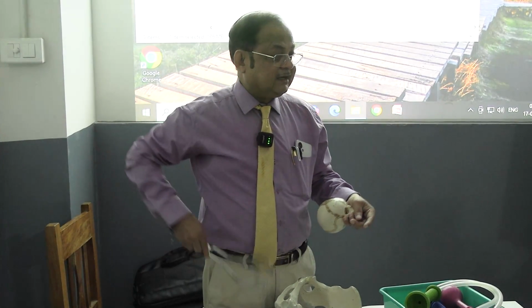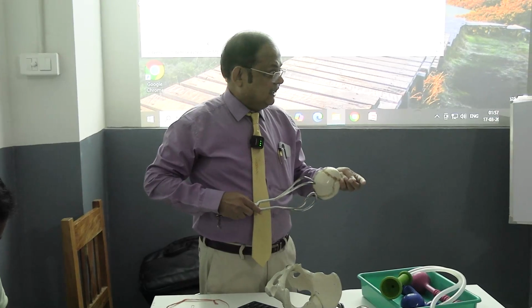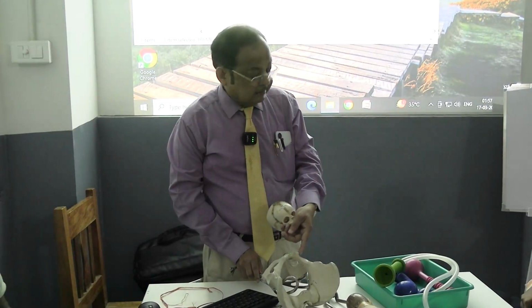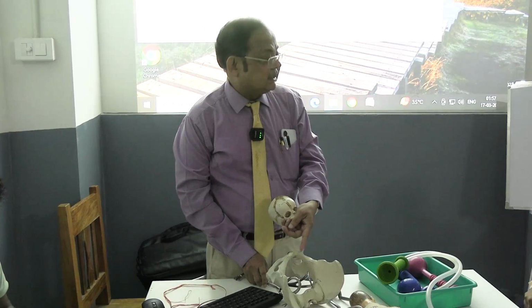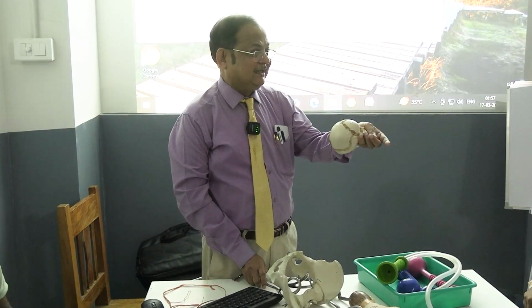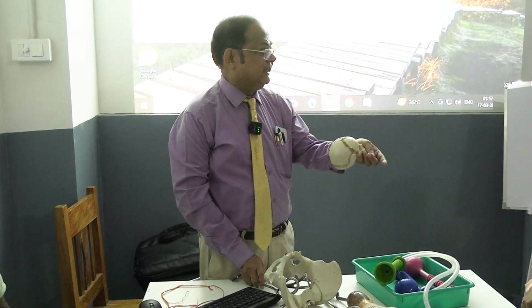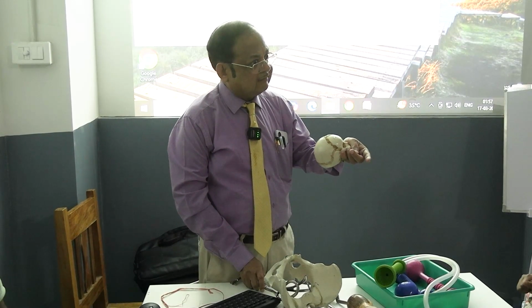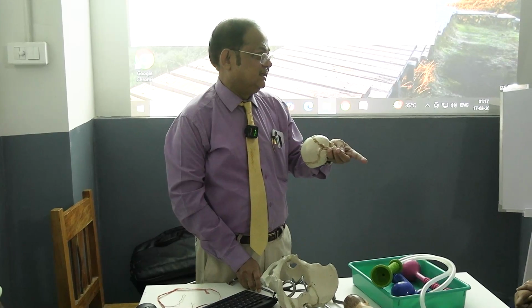Definitely the cephalic, because if you apply knowing only the sacral curvature and ignoring the rotation of the fetal head, there will be injury to the head. So in all cases, we will try to apply the cephalic application.